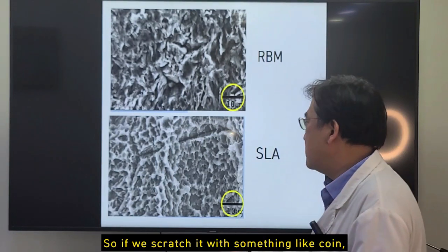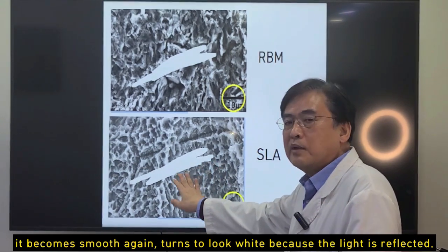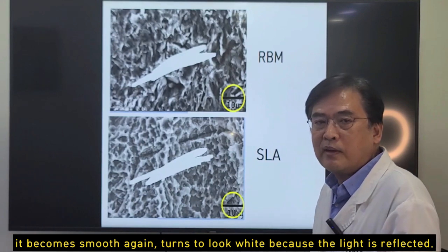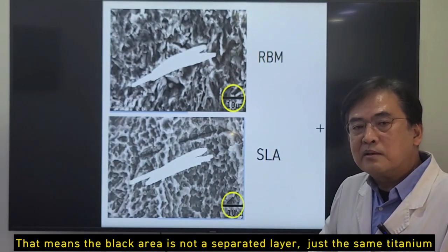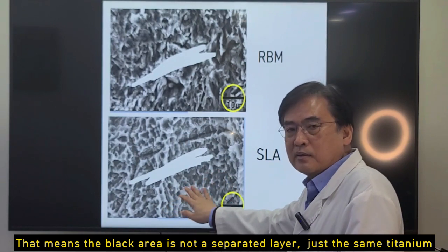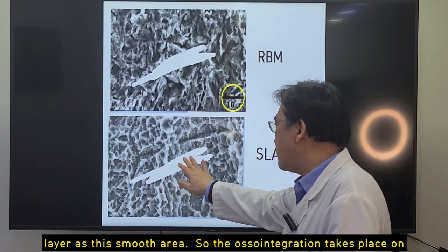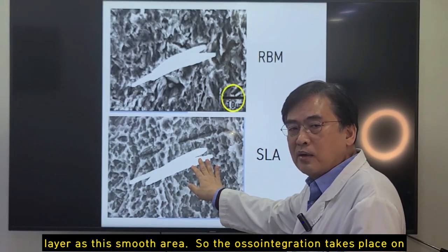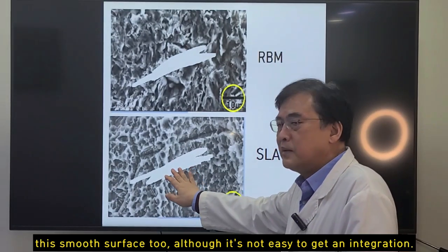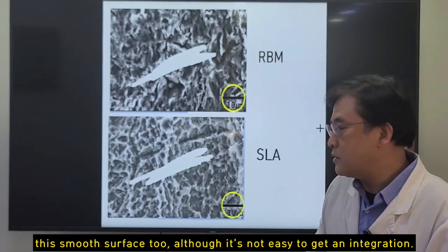If we scratch it with something like a coin, it becomes smooth again and looks white because the light is reflected. That means the black area is not a separate layer, just the same titanium layer as this smooth area. So osseointegration takes place on this smooth surface too, although it's not easy to get integration.